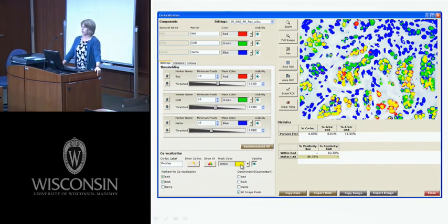And we select that we want the color, when co-localized, to show up as yellow. And so the software very nicely tells us that about 6% of the cells in this particular image have co-localization. And then it breaks it down further, the number percent within the red and the DAB.